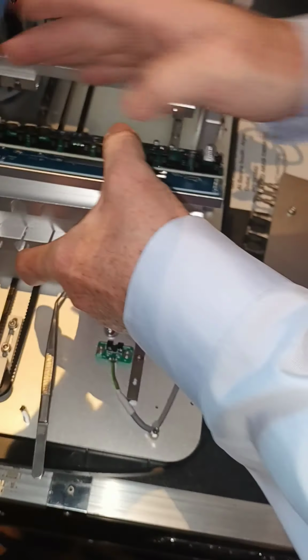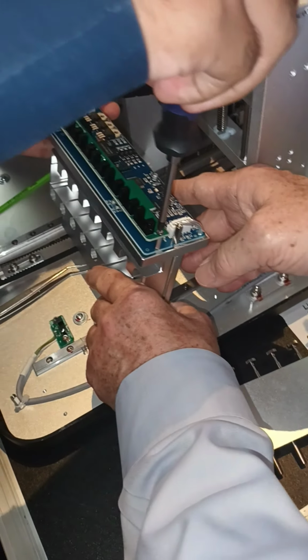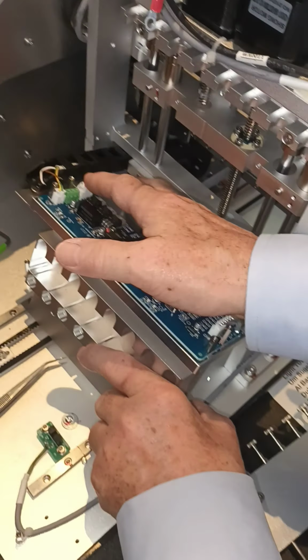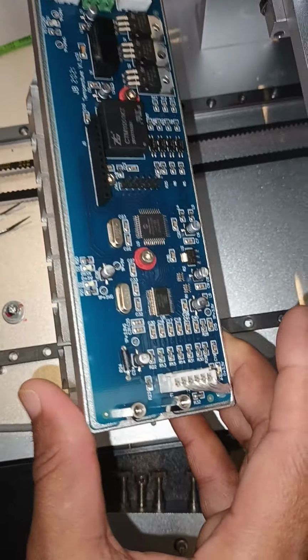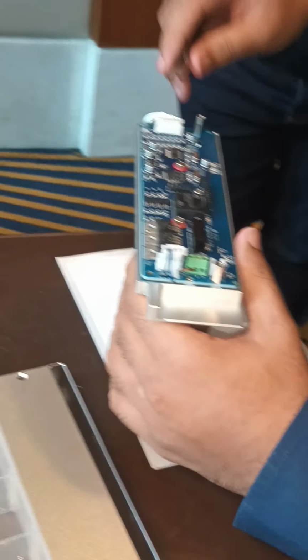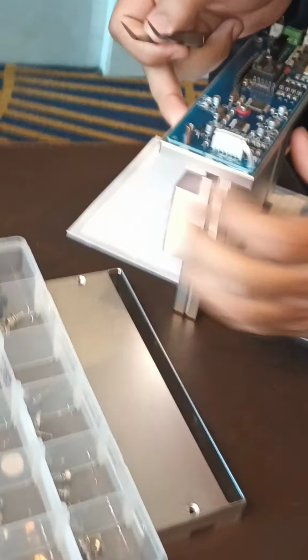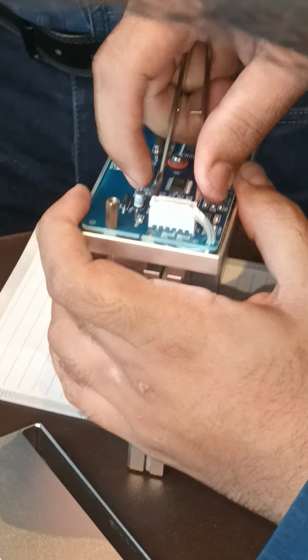Now, get the Phillips screwdriver. Take out these 2 screws. Remove 1, 2, 3. You have to do the first one also, from this side. But don't pull it too hard. You have to stop right after you pull it out. Okay.